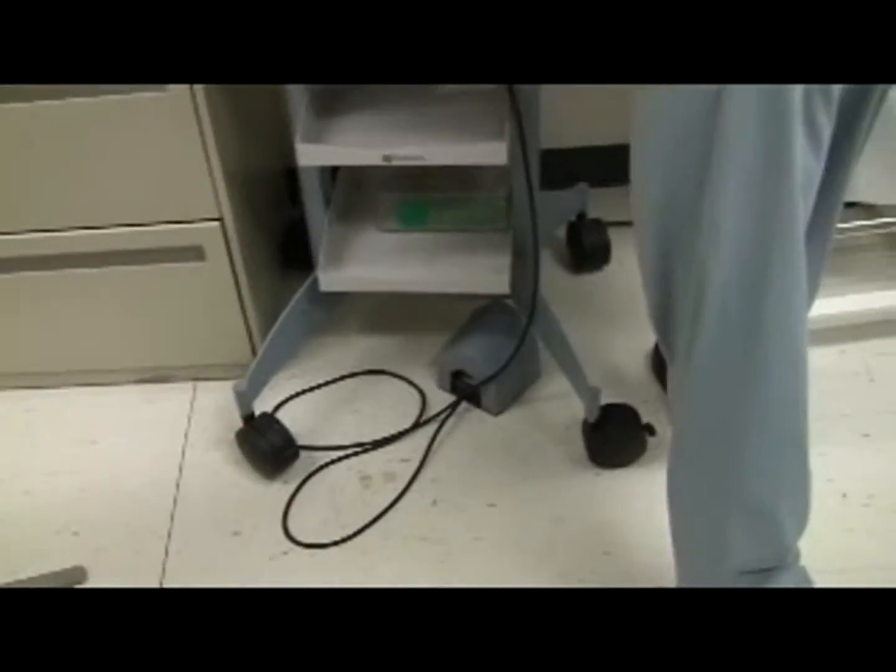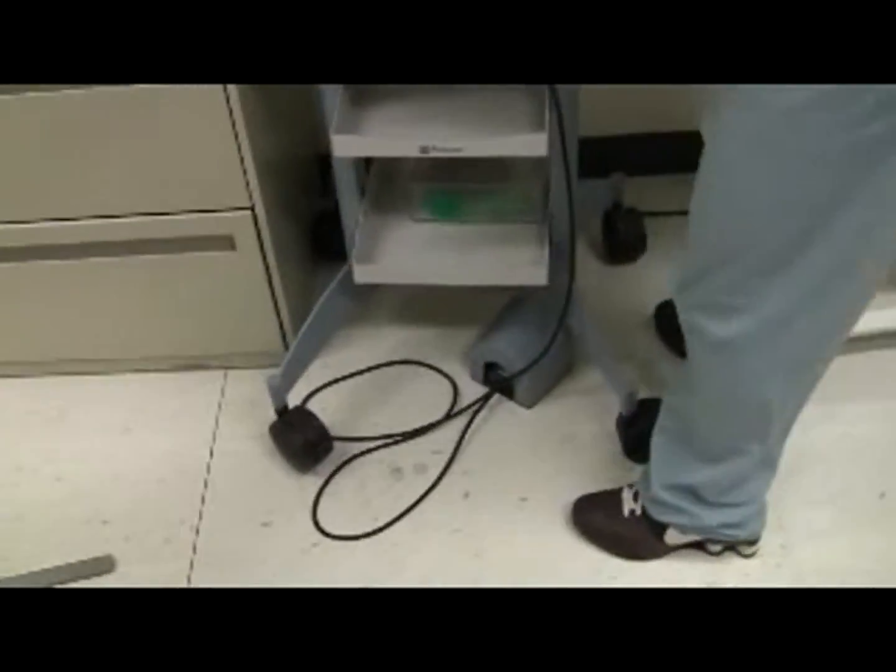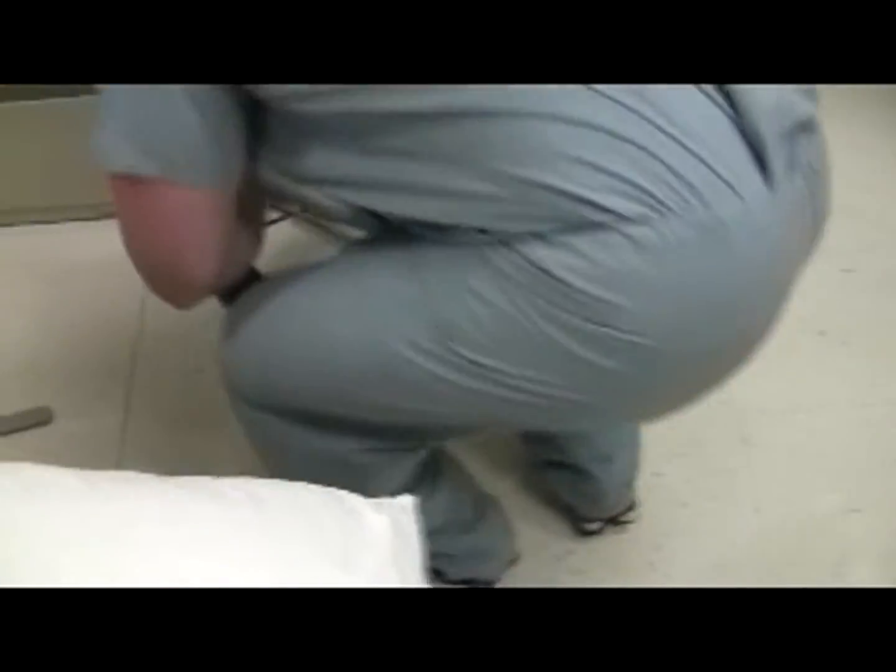This console is on wheels, so we can wheel it out to us. There are locks on the wheels so you have to undo those. They were all locked so we're unlocking all the wheels — this is a practical aspect of using a laser. Here's the foot pedal of the laser — we're going to move that out into a place where we can easily step on it.